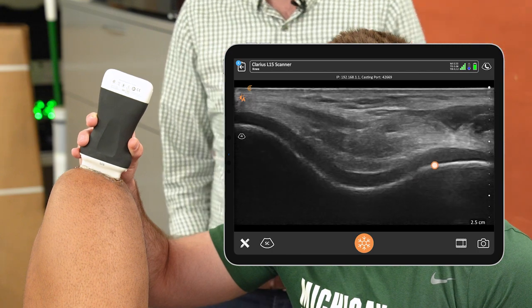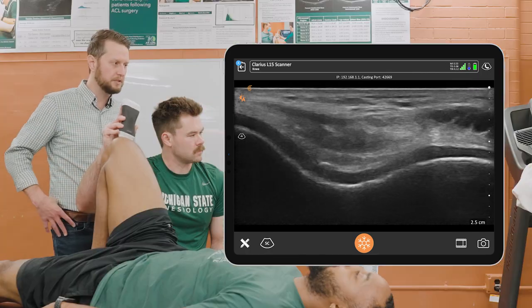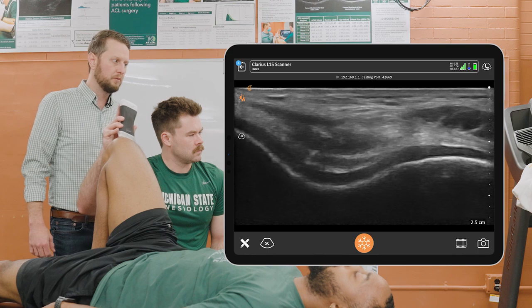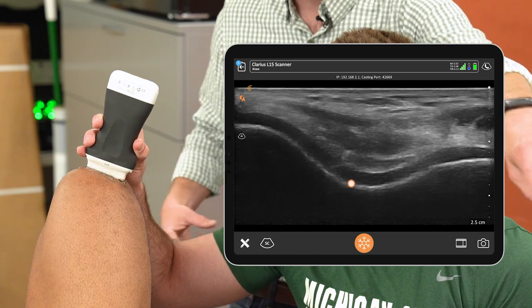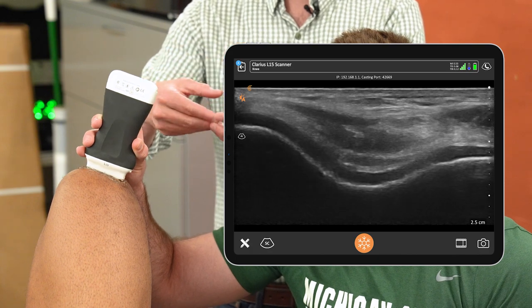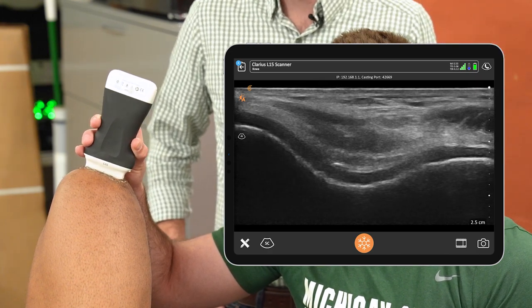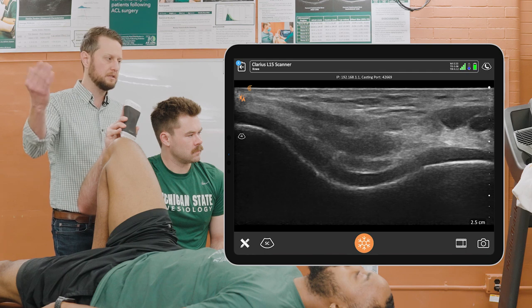With this image, we're focused on that articular cartilage — that black band there in the middle of the screen. What Corey is doing with the ultrasound probe is, once we position it on the knee in line with the medial and lateral femoral condyles, we will move the probe left to right to make sure the intercondylar notch, or the lowest point of the knee, is at the middle of the image. Then we'll rotate it anteriorly and posteriorly to find the position where we have the brightest lines at the bone surface and can see clear delineations between the cartilage and the bone, and between the cartilage and the overlying soft tissue.